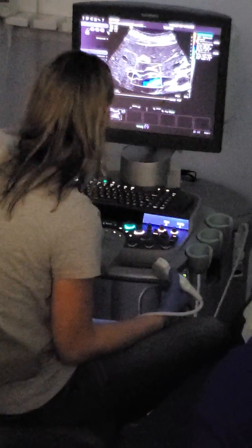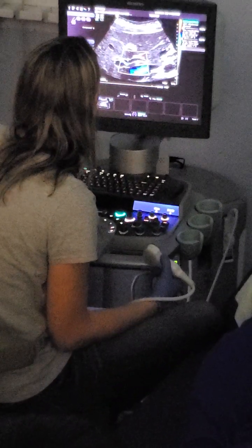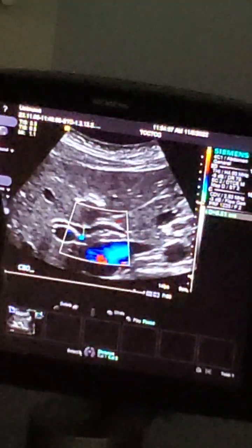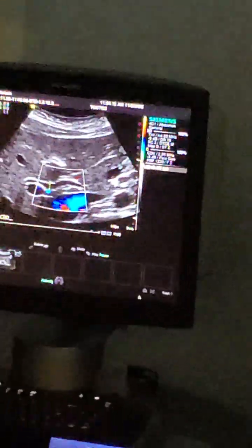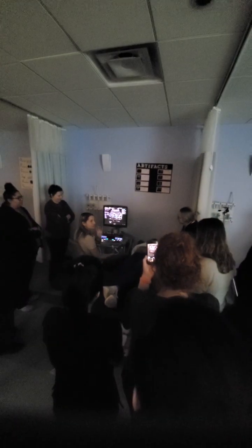So hers trumpets a little bit, kind of widens. So I'm going to measure the widest area. I want to give the worst case scenario. According to your book, it will be normal, but for my work, because you're not 50 years old. But there we go. So we have it totally elongated. Yeah, if you want to do this, it can't hurt.